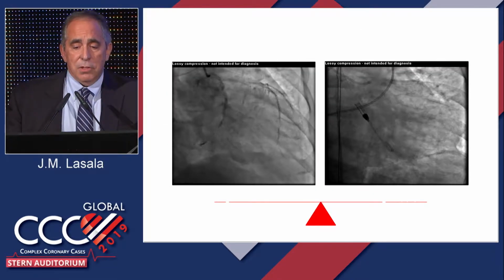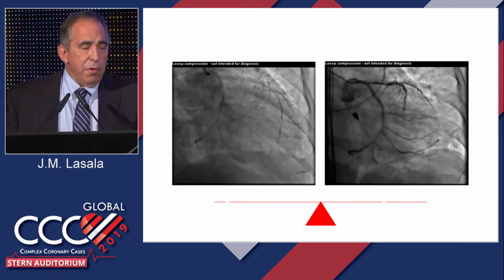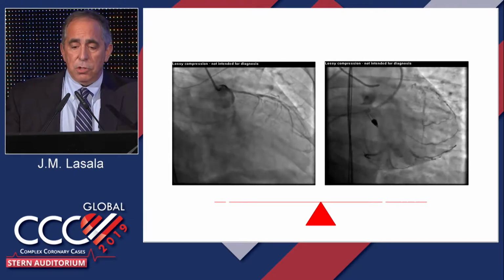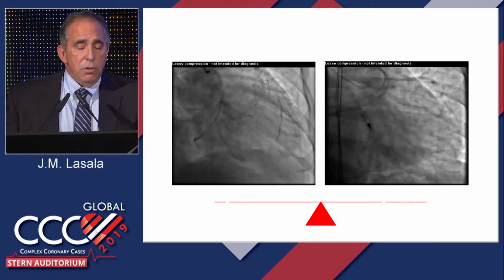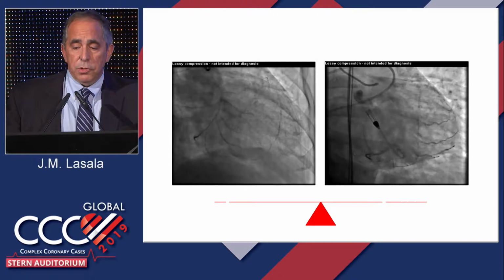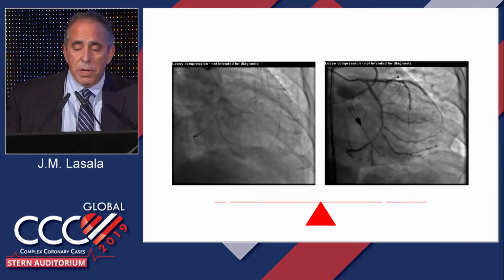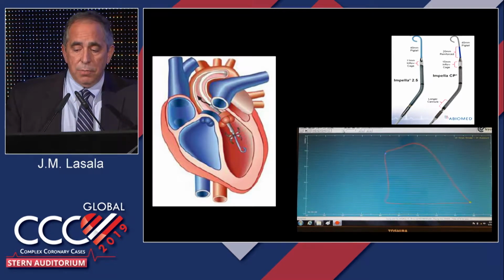For a patient like this that comes in with a previous anterior wall infarct, now having a lateral infarct and a left dominant circulation with a starting blood pressure of 70, just opening up the vessel may not be enough. Putting them on hemodynamic support first provides us with the opportunity to get back normal flow and a potential for restoration of left ventricular function.